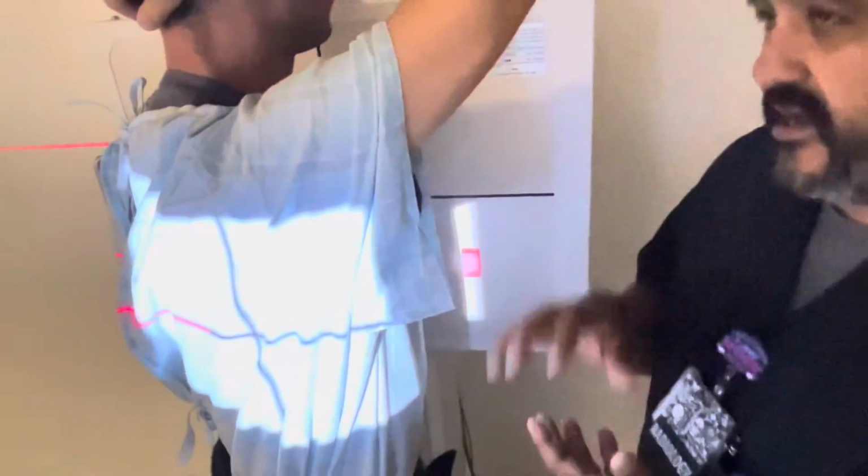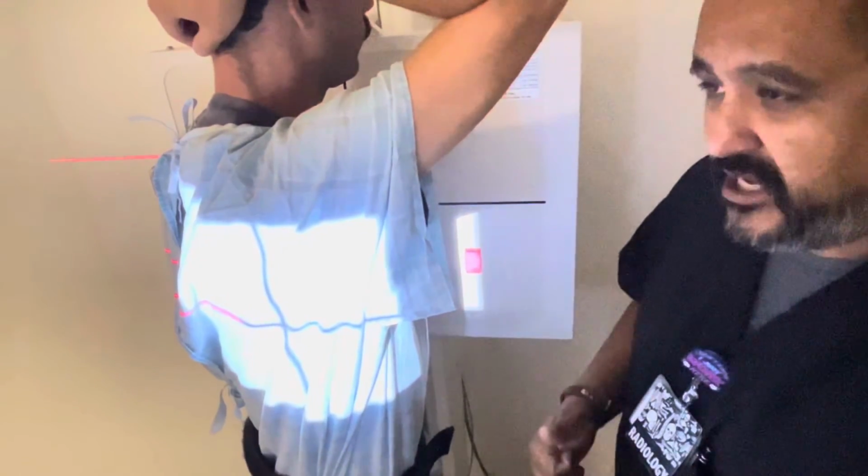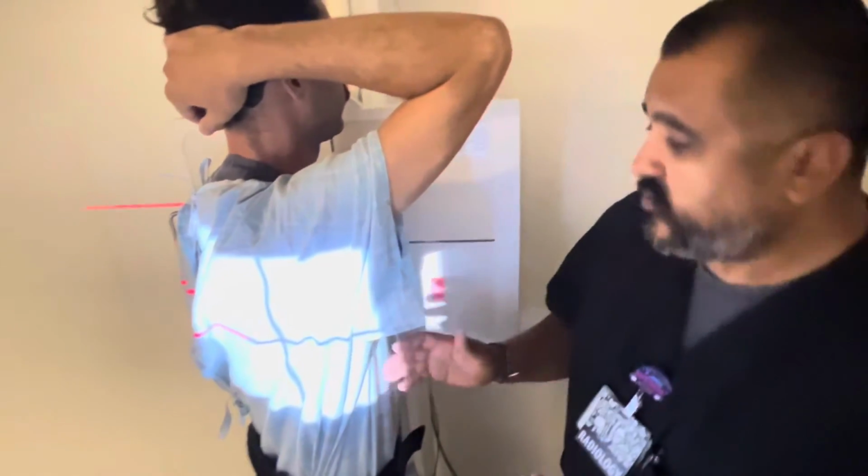So now we're going to have the patient breathe in, let it out, breathe in again, and hold it. X-ray clear, beep. All right, technical factors were the same as we did for the posterior ribs. We have it at about 15 mAs at about 74 kV.